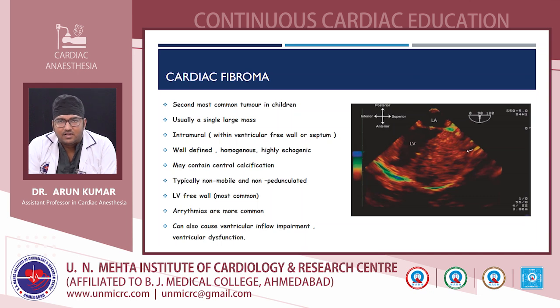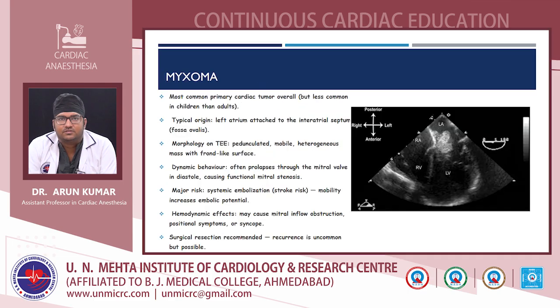And this image shows a fibroma attached to the LV free wall, and this fibroma is very large and circumscribed, and also, as you can see, it is highly echogenic, and it has echolucent areas suggesting cystic degeneration or necrosis.